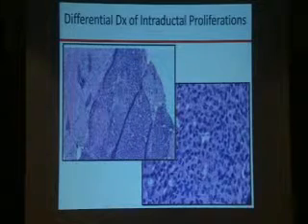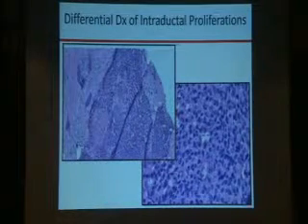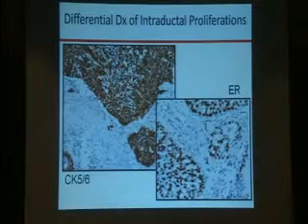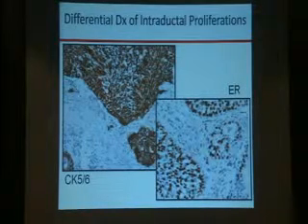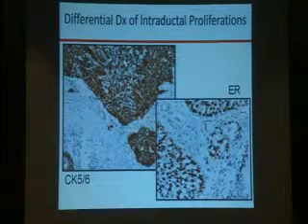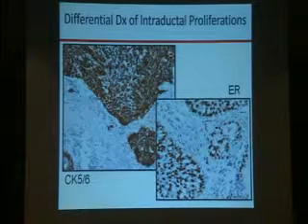Another case of epithelial proliferation involving a sclerosing lesion, cells are spindle, and there is a mosaic pattern of cytokeratin expression and ER positivity, but not uniformly positive, with negative cells.